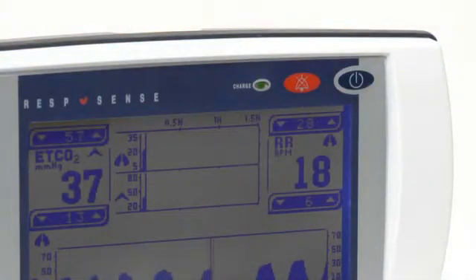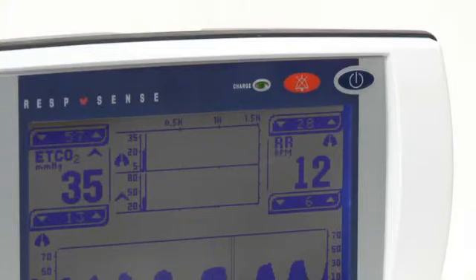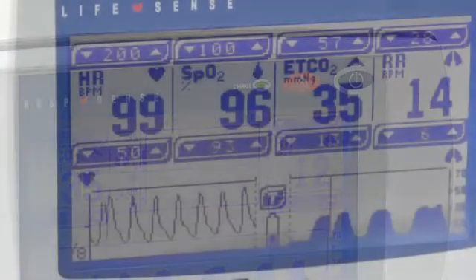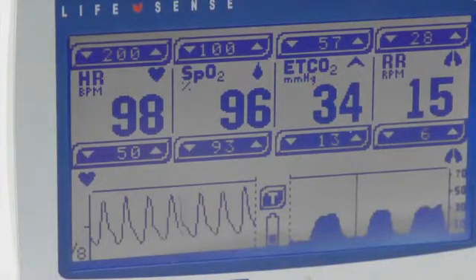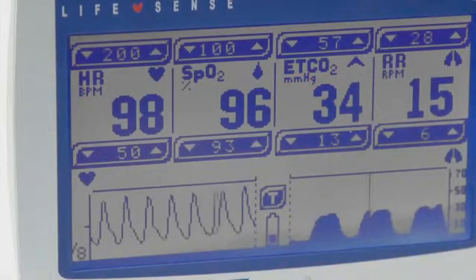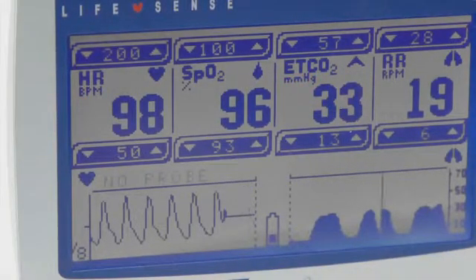The capnography functions are the same on both the RespSense and LifeSense models. The additional LifeSense SpO2 and pulse function will be described later in this video.